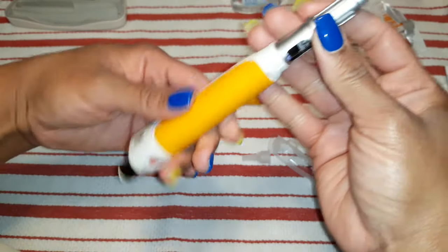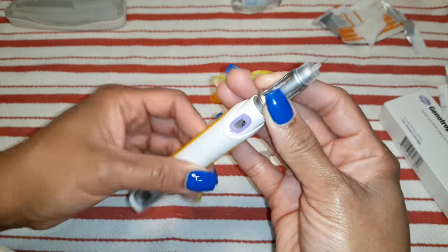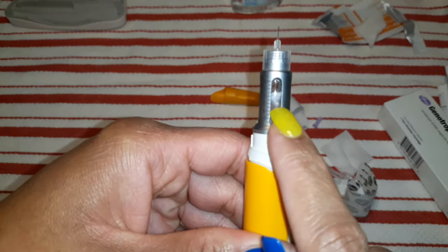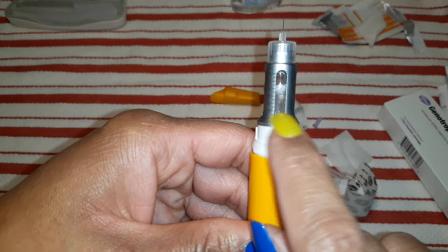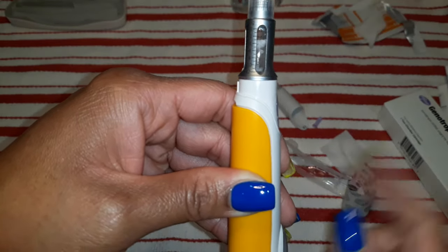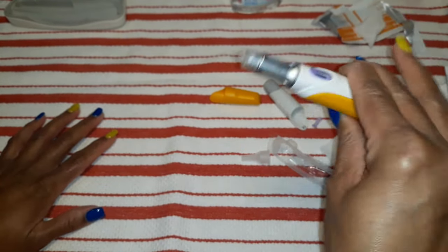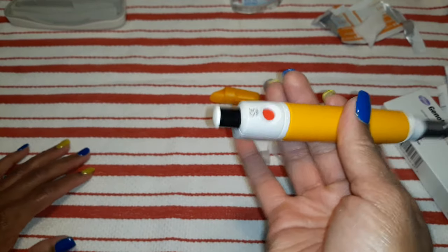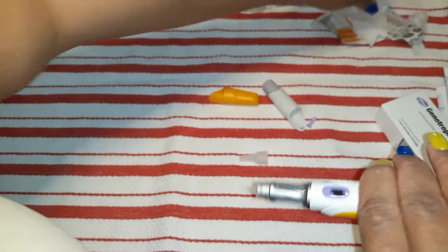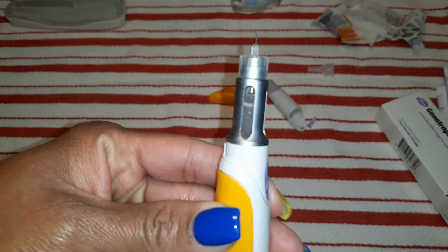Now I'm going to take this off to expose the needle — be careful not to poke yourself. I'm doing this so that you guys can see if any of the medicine comes out where the air is being released. Now if you look here, you can still see that white powdery substance mixed with the liquid. Whenever you twist this down, it pushes it up kind of like a push pop. You don't shake — you gently rock to mix the powder and the liquid together.